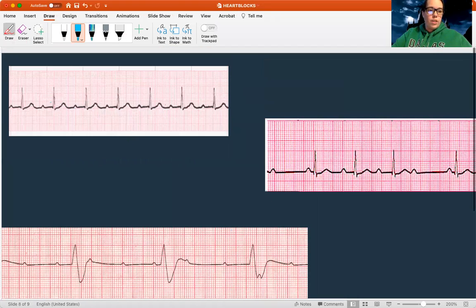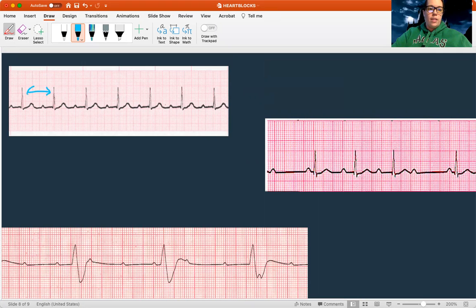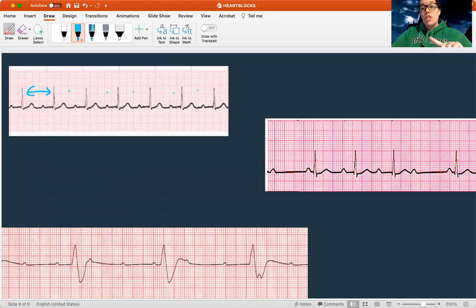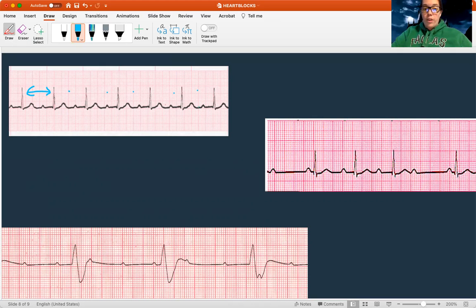Let's do some practice. Looking at this first one — is it regular? Is there the same distance between each beat? Yes, there's the same distance throughout, so it's regular. That means it has to be either a first or third degree. Now looking at the P waves — there's a P wave for every QRS. The only thing that's off is that the PR interval is long. So this is a first degree block.